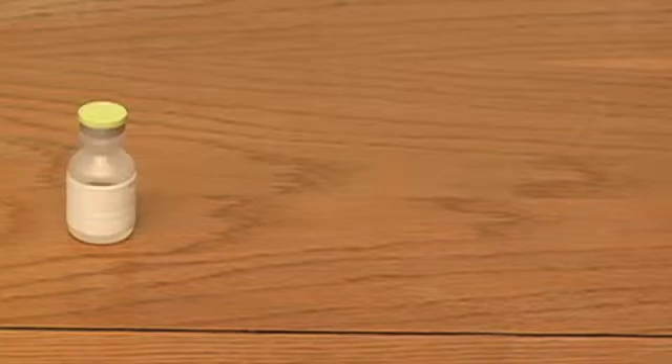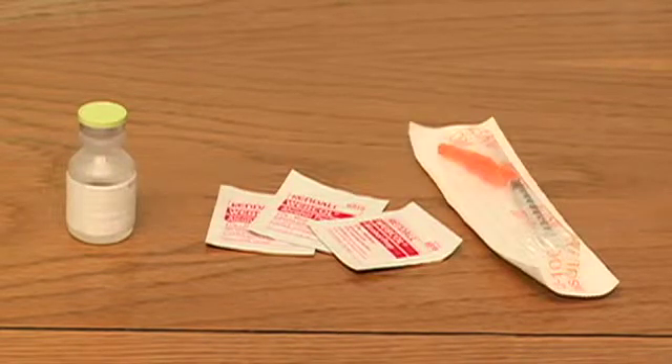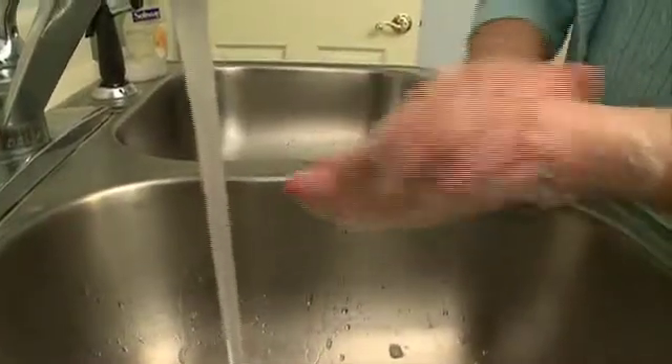Start with a clean, dry surface. You'll need the vial of medication, alcohol pads, and a syringe with attached needle. Complete your hand hygiene.